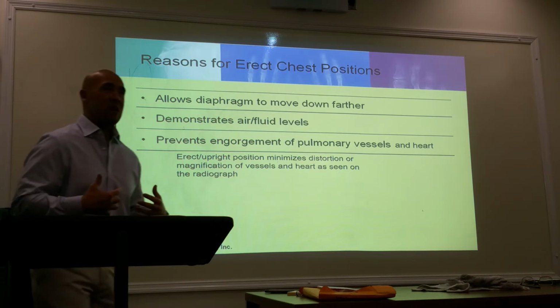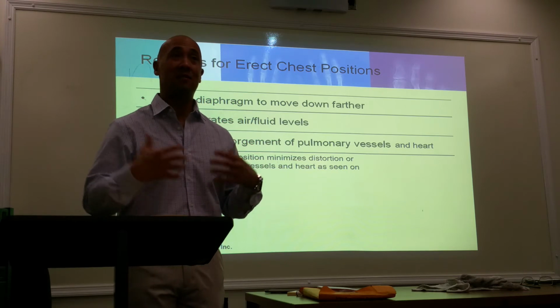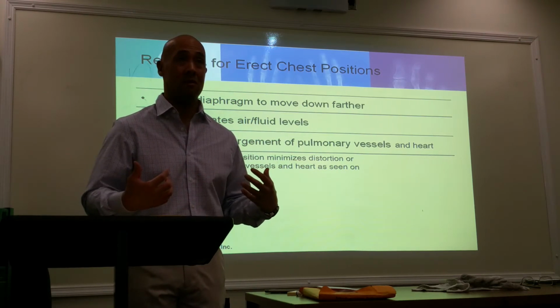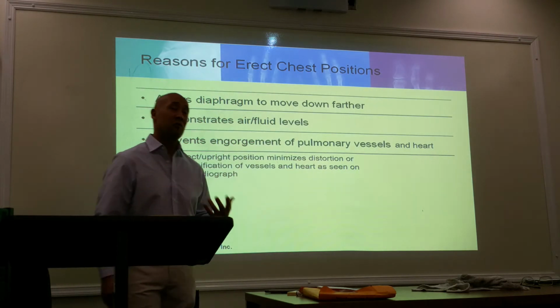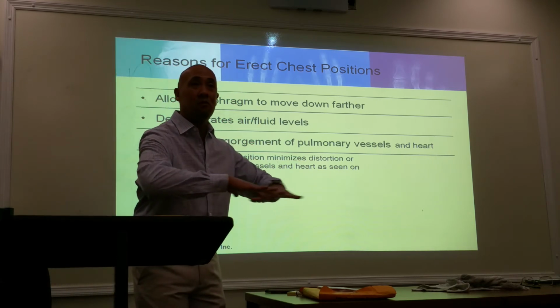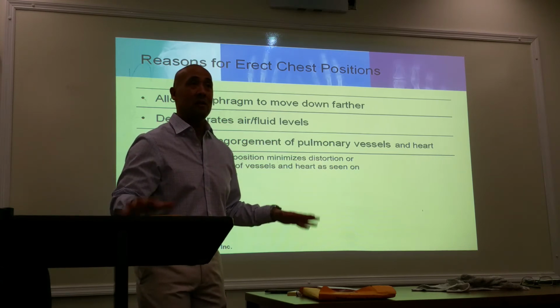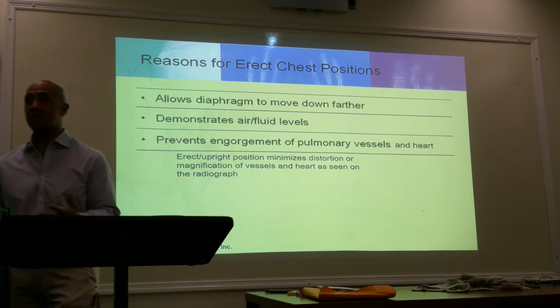When you're laying down, everything kind of just spreads around and everything becomes engorged because the fluid, especially in your vascular system, is not moving anywhere. Now think about this. If you are laying on your back and you had fluid levels, are you going to see the fluid levels? Because when you're laying down, everything just kind of spreads out. So now you're not going to see the fluid levels. So the best way to do this is in some kind of upright or erect position.